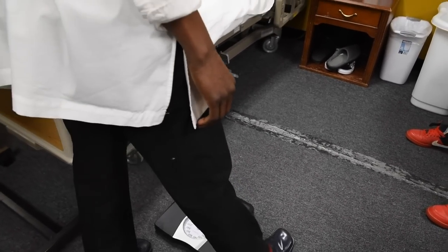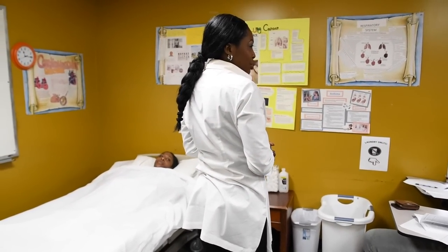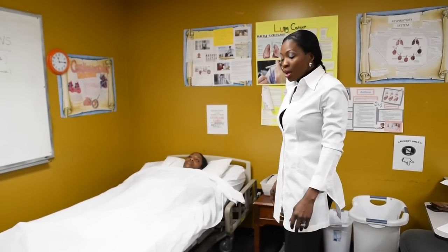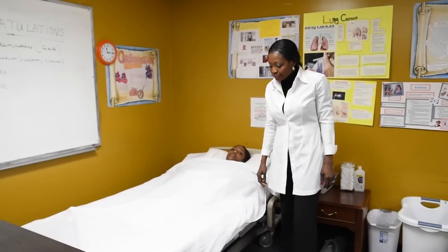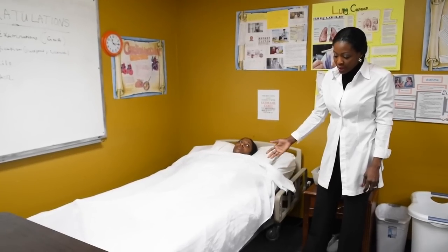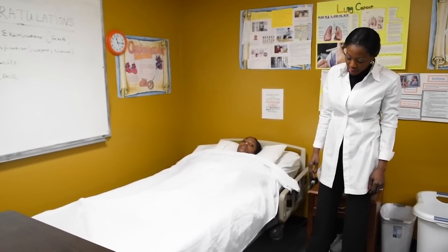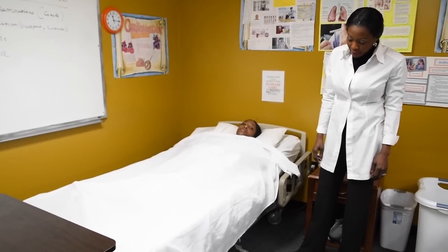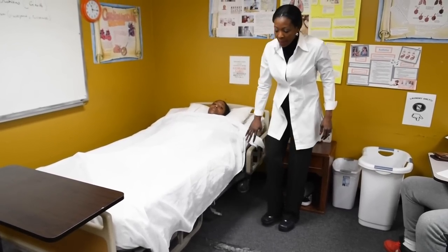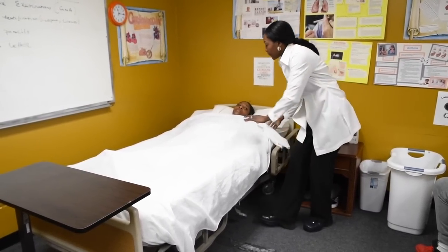Another equipment you will need is the patient's shoes. So just write shoes as well. So we have the scale. We have the patient's shoes as well. Now, when you finish, watch. So I've already told the patient what I'm going to be doing, which is to weigh her. This is what you tell the examiner. I've locked the bed for safety, and my bed is in the lowest position for safety as well.